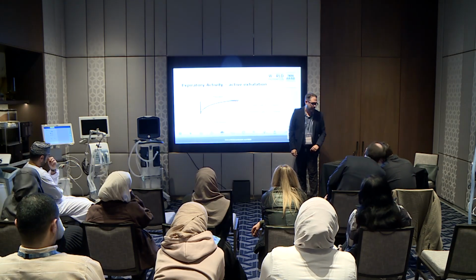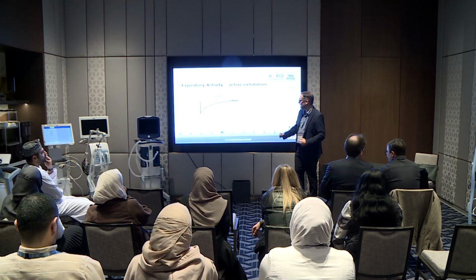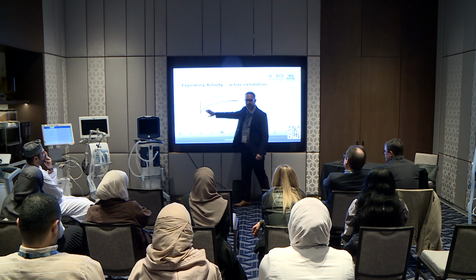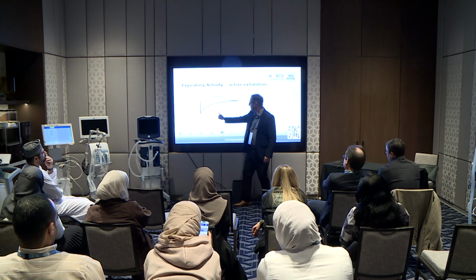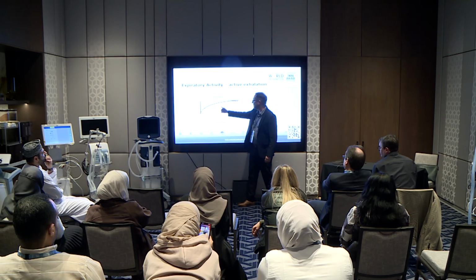Okay? Now, if a patient is forcing exhalation, so when they're forcing it out, rather than going nice and exponential, you should see an exponential curve during exhalation. If the patient is forcing it, it may start and then it sort of rounds out like this. And then sometimes some patients will breathe out and then they'll force out.